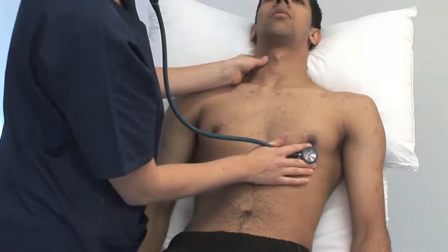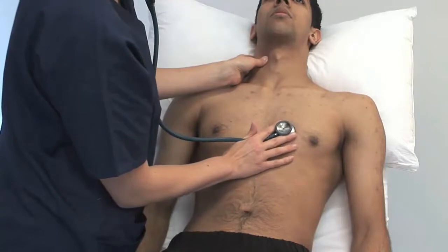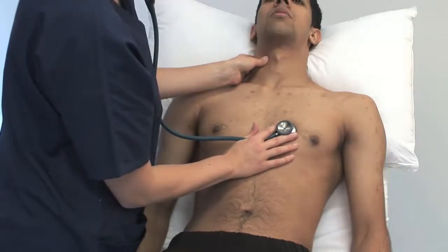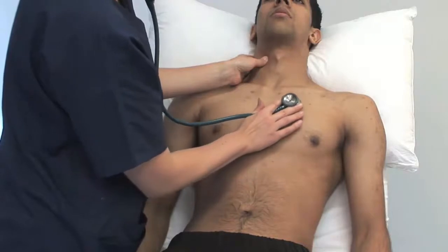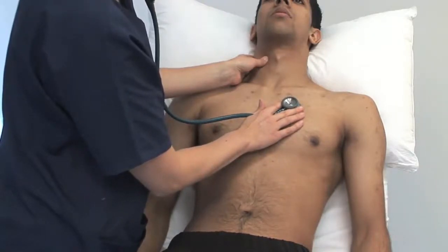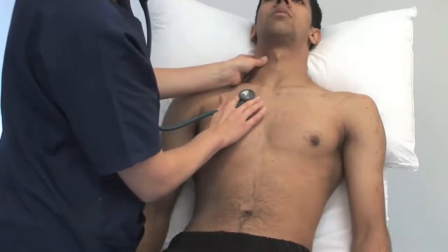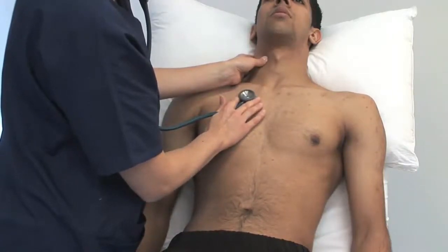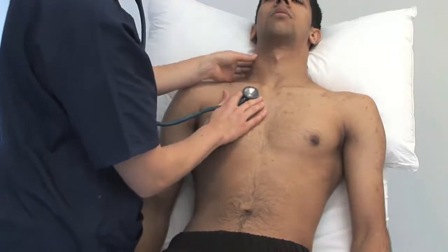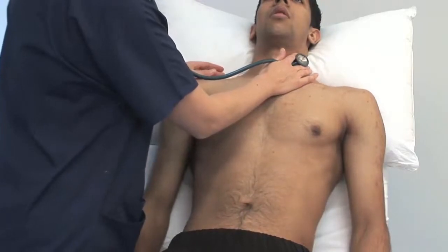Listen at the apex where you felt the apex beat — this is a good site to hear mitral murmurs. The lower left sternal border is the best place to hear the murmur of a VSD. The upper left sternal border is the best place to hear pulmonary valve murmurs. And the upper right sternal border is a good place to hear the murmur of aortic stenosis. Please take a breath in and hold.